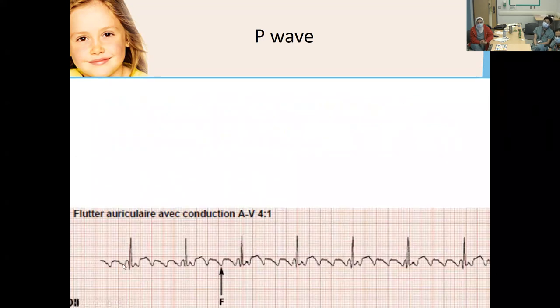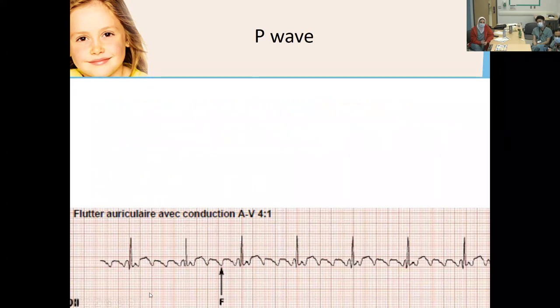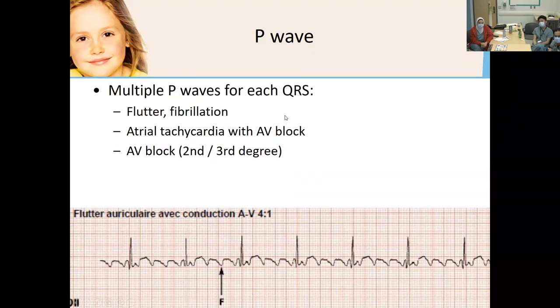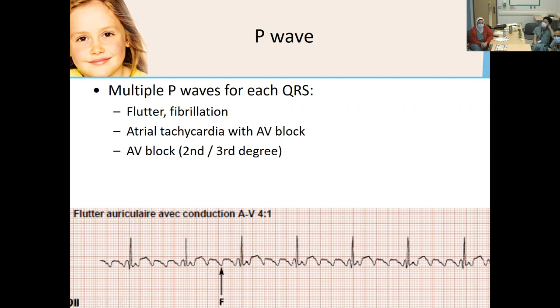An example of atrial flutter shows a sawtooth pattern — multiple P waves per QRS. This requires asking: is there a block causing that, or are the atriums contracting too quickly for the ventricles to follow? In atrial flutter or atrial fibrillation, the atriums depolarize too rapidly for the ventricles to keep up, but ventricular rhythm can remain relatively normal.